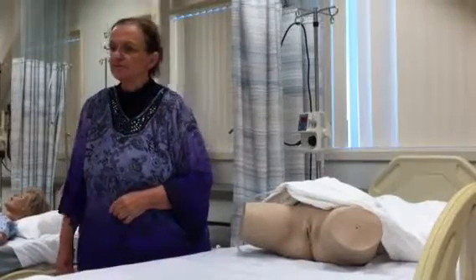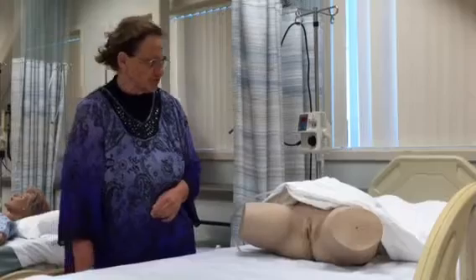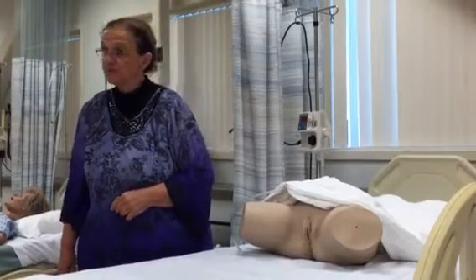Hello, my name's Terry Rudd. I'm going to demonstrate the use of putting in a urinary catheter in a female.